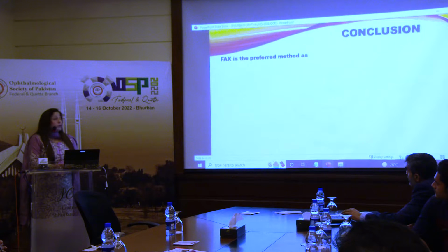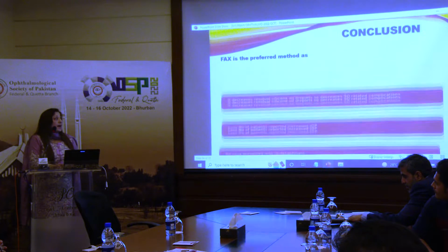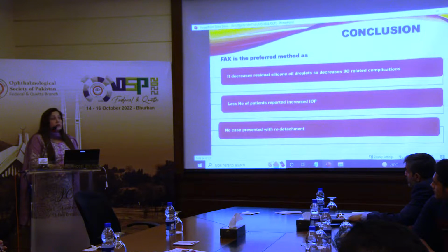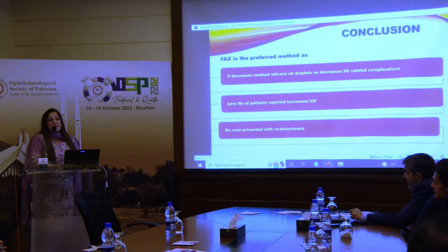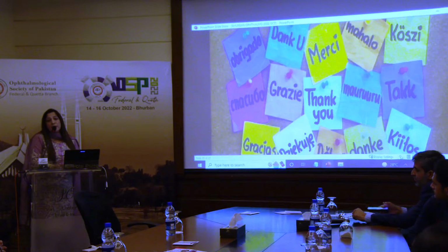In the end, I would like to conclude that fluid air exchange is the preferred technique as it decreases residual silicone oil droplets, and so decreases silicone oil related complications. Fewer patients reported increased intraocular pressure after fluid air exchange, and no case presented with redetachment after fluid air exchange.